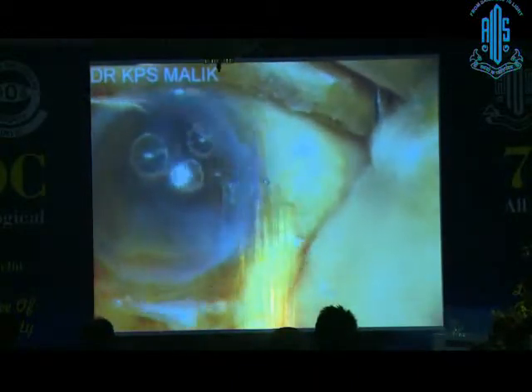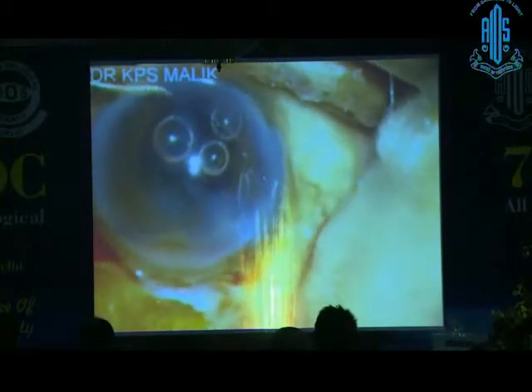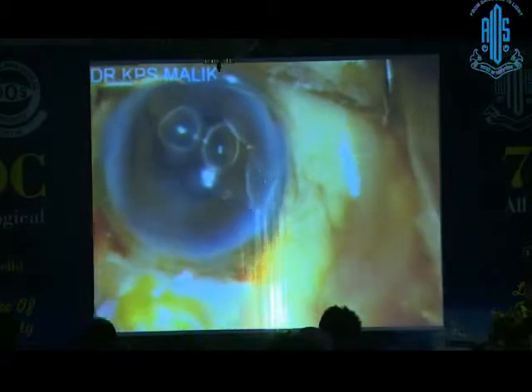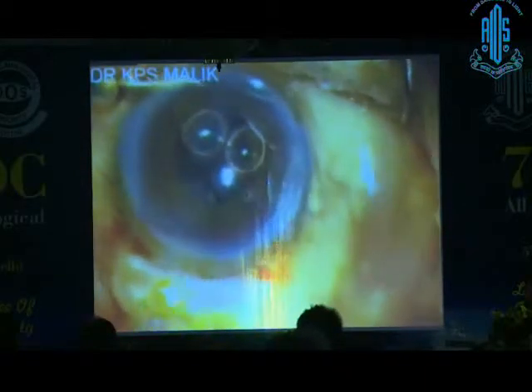The chamber is full of VISCO — dispersive VISCO, which is cheap, which is methylcellulose. You can see it sticking on the back of the cornea, and the bubbles would not go till the end. We have done the calculation — endothelial cell counts are much better with this technique than with any VISCO in hard cataract.